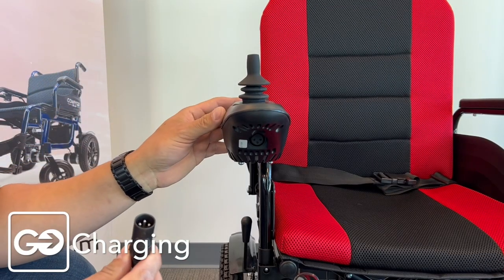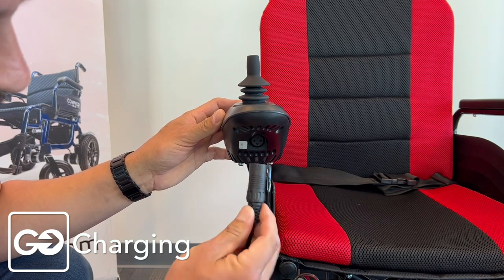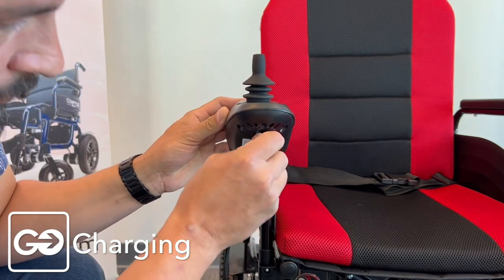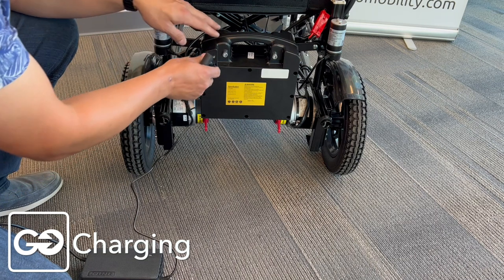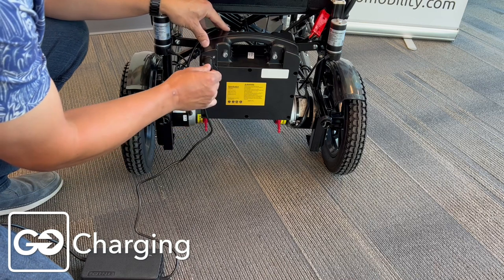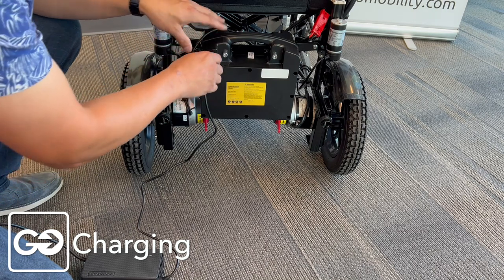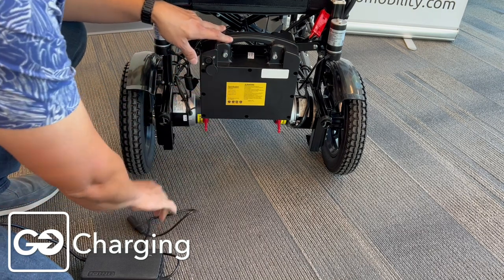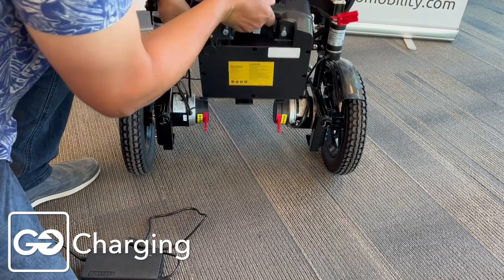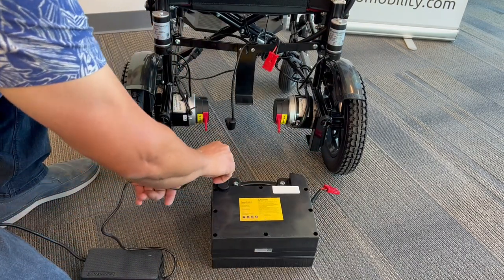Charging the X9 is very simple. Our analog controller has a charge port right underneath that matches our three-prong charging adapter. Match the three prongs up to the three holes and press it directly into the charging unit. Here's a second option for charging the battery: take the three-prong adapter and our charger's three prongs match right up to charge the battery directly. If you need to charge your battery independently of your chair, remove the power cable from the battery, lift the battery off the back of the chair, and charge it inside the home by plugging it directly into the wall.